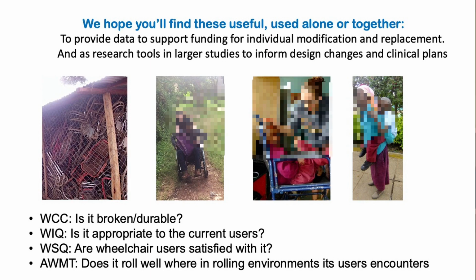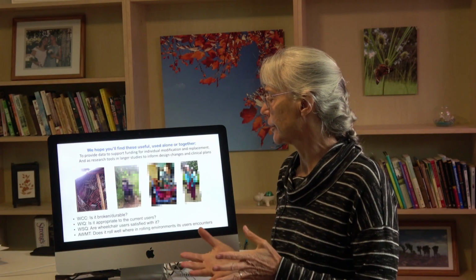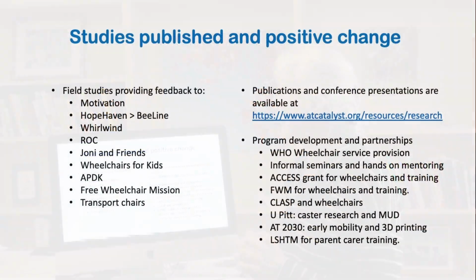The wheelchair components questionnaire, is it broken? The wheelchair interface questionnaire, is it appropriate for the current user? The wheelchair satisfaction questionnaire, are the wheelchair users satisfied with it? And the aspects of wheelchair mobility tests, does it roll well? These studies have sparked positive change. Here's some of the different wheelchairs we've had in our programs.